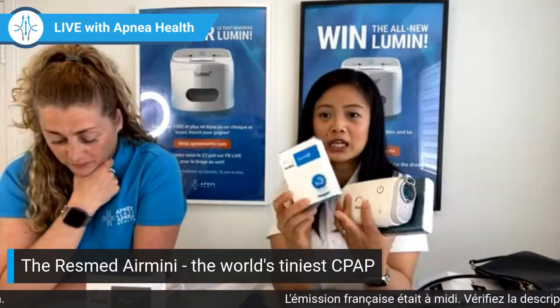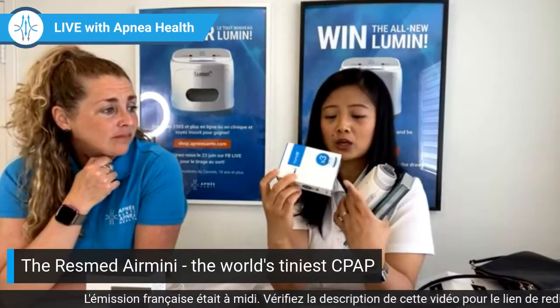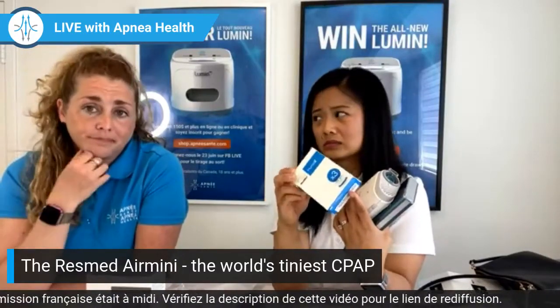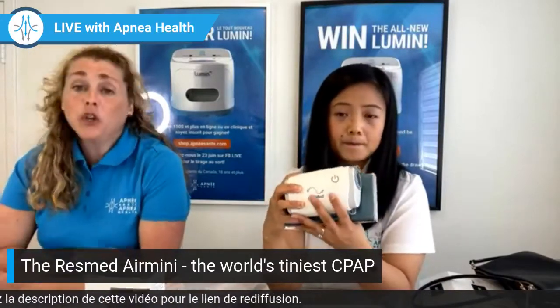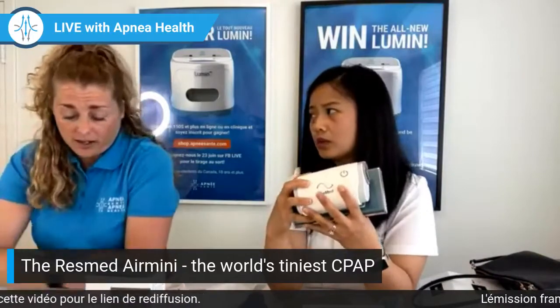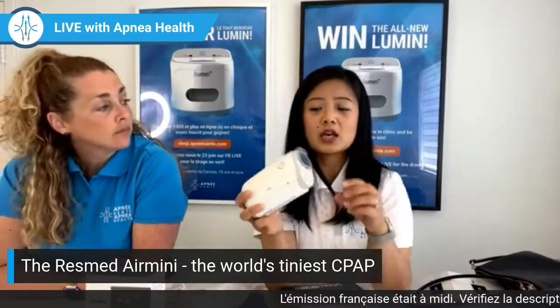Yeah, 30 days. And I'm going to be honest, it can get very expensive compared to buying water. That would be a con for the Airmini, if you're using it all the time, constantly.